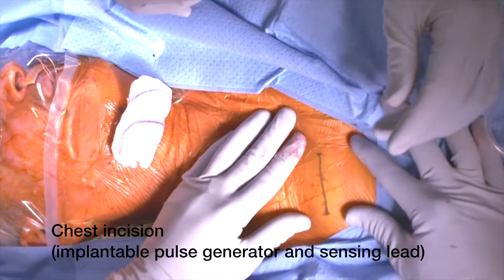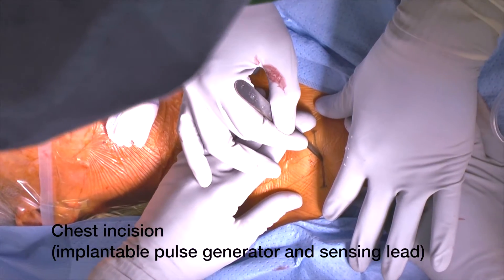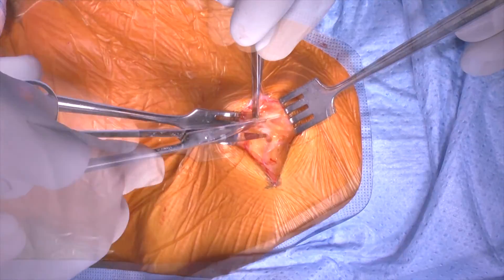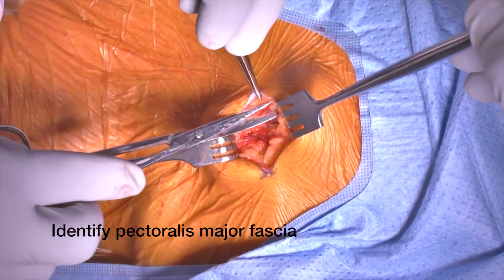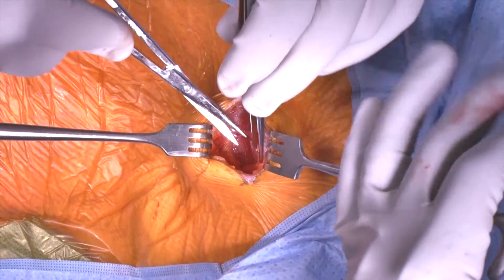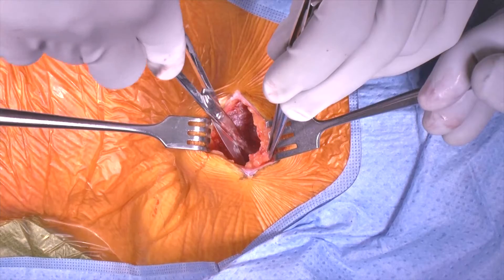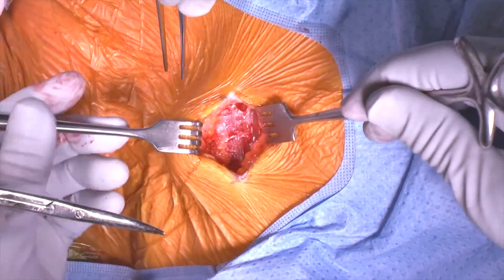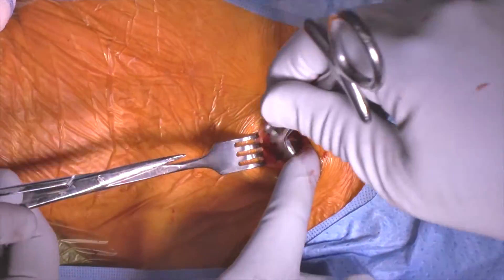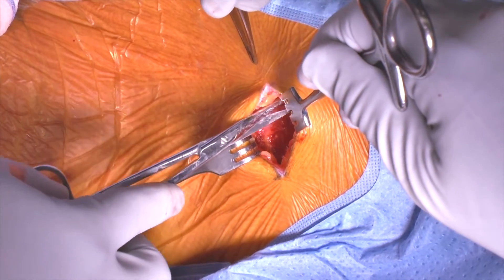The next part of the operation is placement of the implant pulse generator and the respiratory lead. We dissect through the skin and get down to the fascia of the pectoralis major muscle, which we've identified here. Now we're going to make a small pocket to accept the implant pulse generator above the pectoralis major fascia. We like to make this pocket not too big and certainly not too small — that prevents issues surrounding movement of the implant and seromas. Typically about one or two finger breadths in size and approximately two or three centimeters inferior to the incision is adequate.